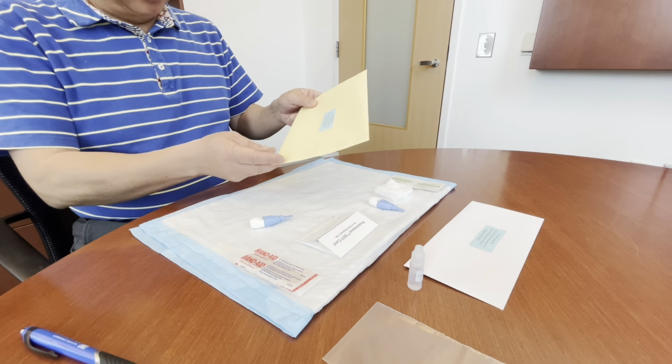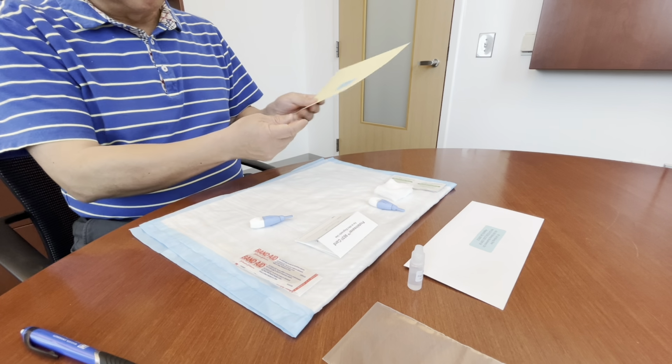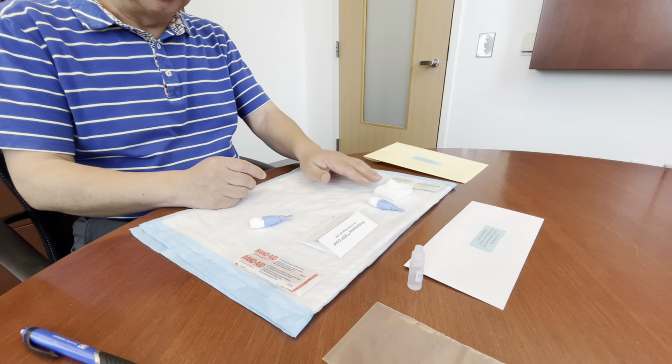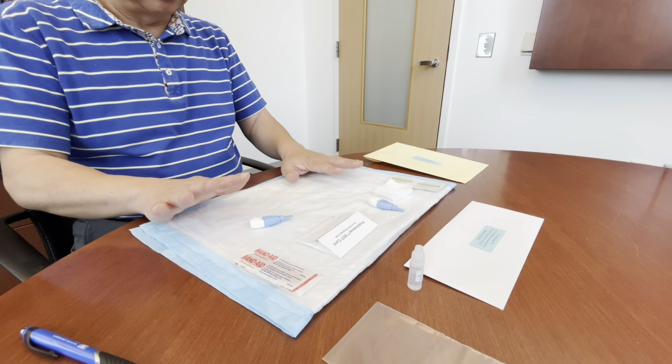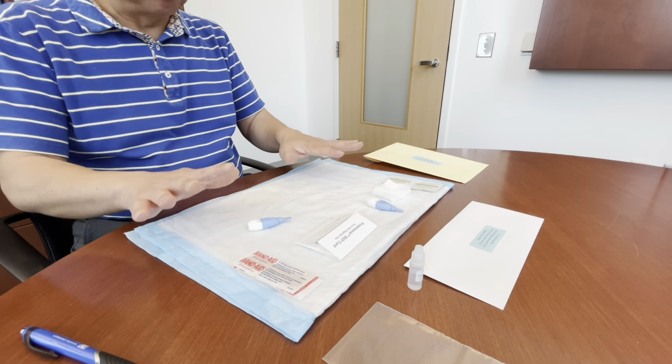Your sample collection kit will arrive in a yellow envelope like this one. Take out all the kit components and arrange them on your workspace. You may want to place a paper towel across the surface.